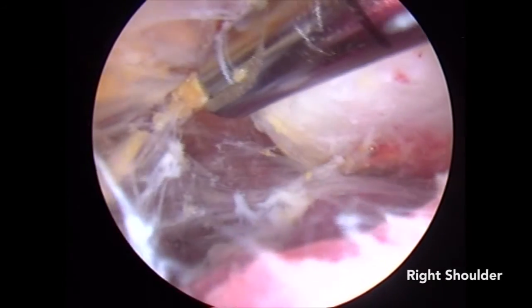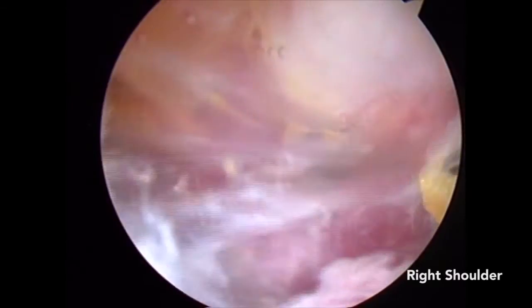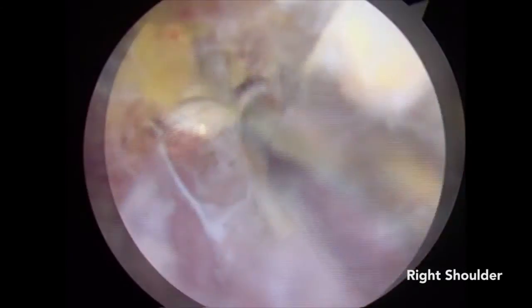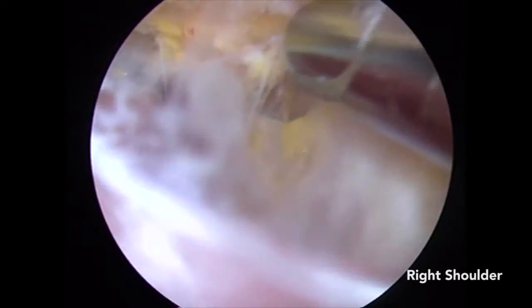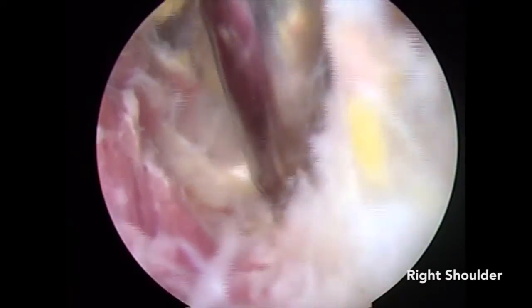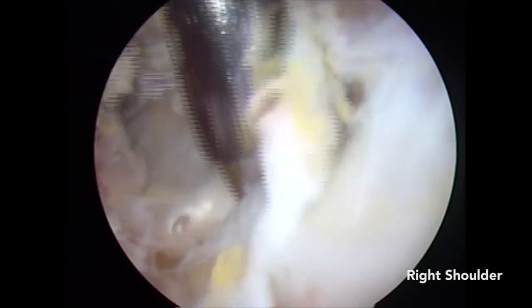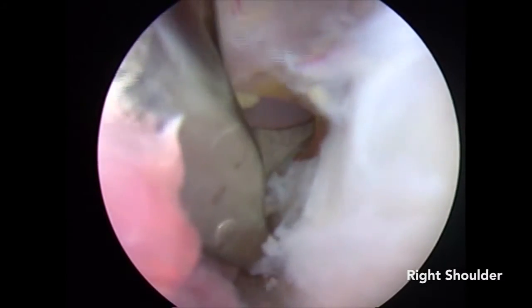With the arthroscope in the lateral portal, a mechanical shaver through the anterolateral portal is utilized to debride bursal tissue and create adequate visualization for creation of the Neviaser portal. A mechanical shaver through the anterolateral portal is also utilized to debride adhesions and fascial connecting bands; care must be taken to not disrupt the coracoclavicular ligaments. Once the Neviaser portal has been created, a switching stick is placed to elevate the anterior soft tissues to create a working space. An arthroscopic biter through the Neviaser portal can then be used to divide the ligament.